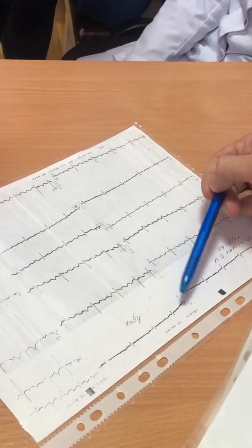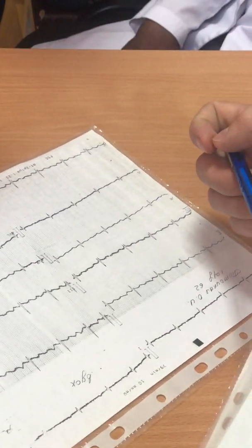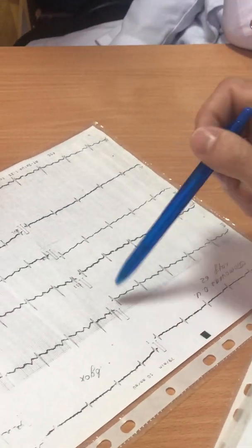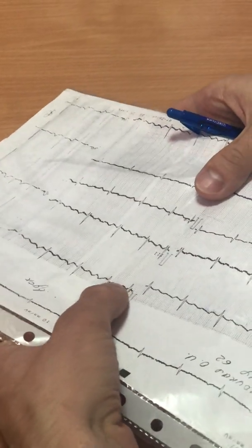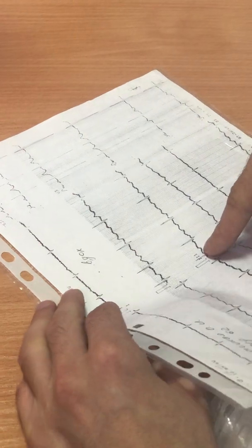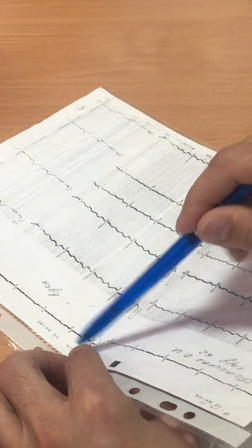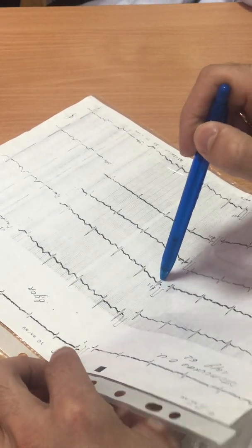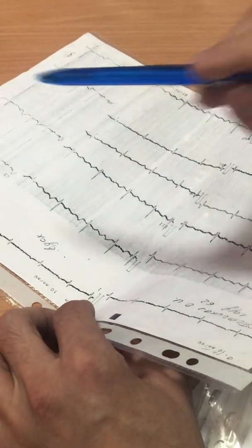Next one, you need to check electric axis of the heart. You need to compare R waves in first, second and third leads. I take ECG like this: first lead in left arm, third lead in right arm. If the biggest wave is in my left arm, it is shift to the left. If the biggest wave is in right arm, shift to the right. If the biggest wave is in middle, it is normal electric axis of the heart.